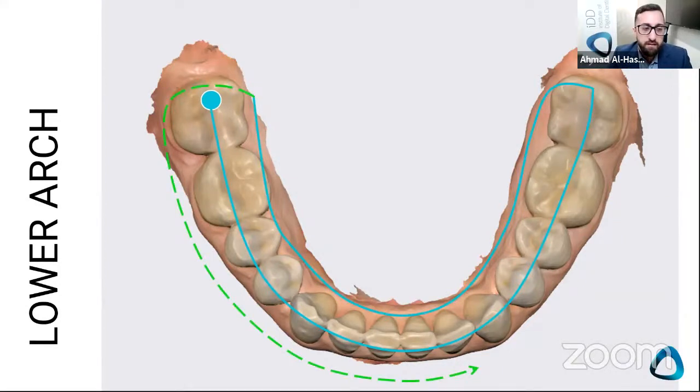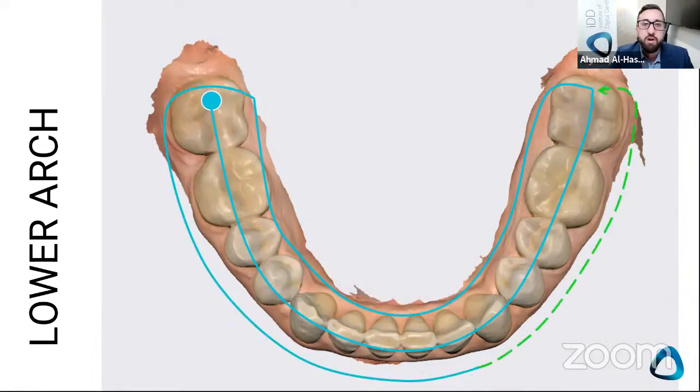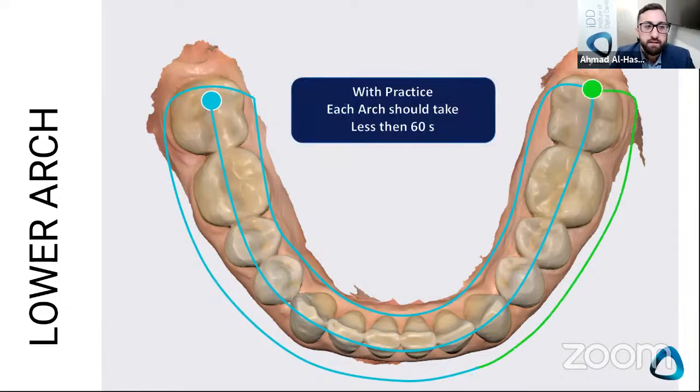Rotate to the buccal. At the front, you may need to stop and reposition your hand. That's really common. I wouldn't start and stop the scanner too many times. Just keep the scanner going, but don't just pull it out of its line of sight, basically, out of its depth of field, and it won't scan anything. And then you're going to rotate and go right to the end. Now, with practice, the key thing is, guys, with practice, each arch should take under 60 seconds.